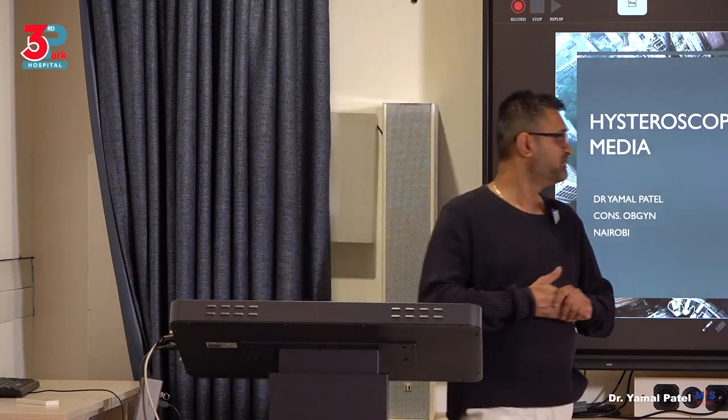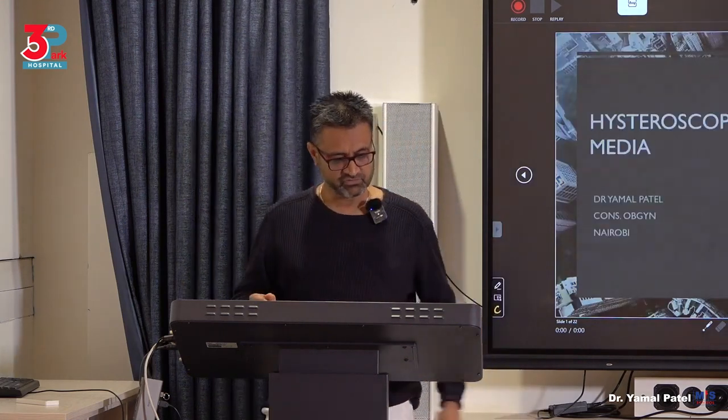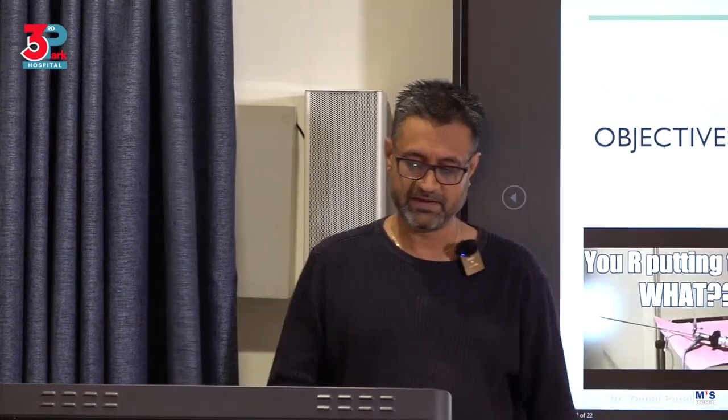So we move on to hysteroscopy media. So it's very important to understand media as well. So good morning again. Let's talk about hysteroscopic media.